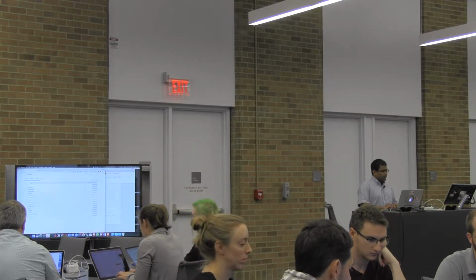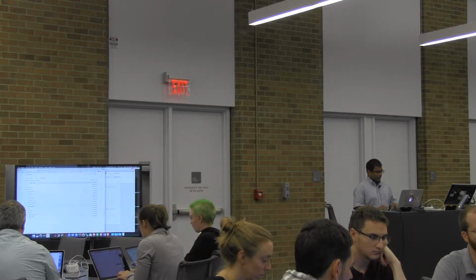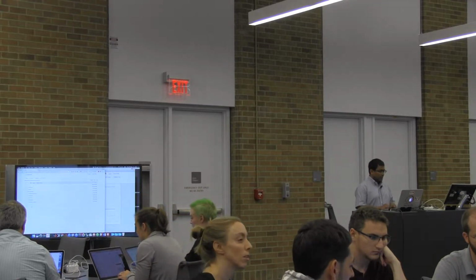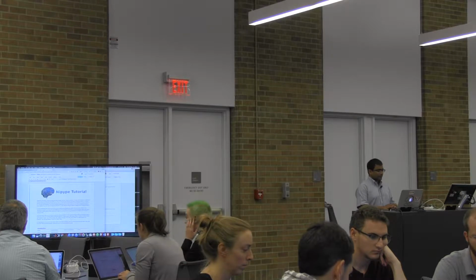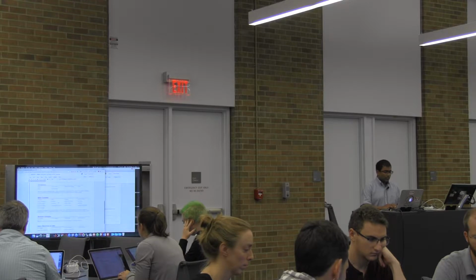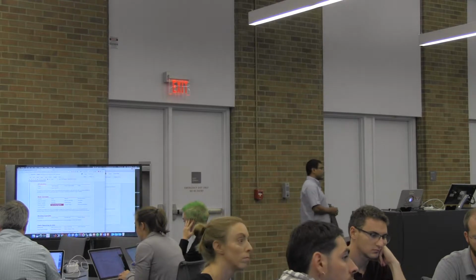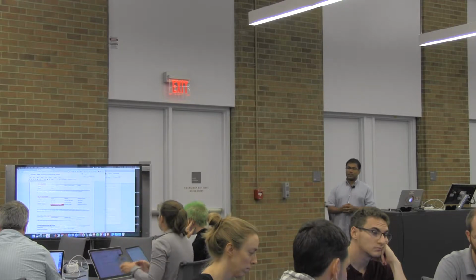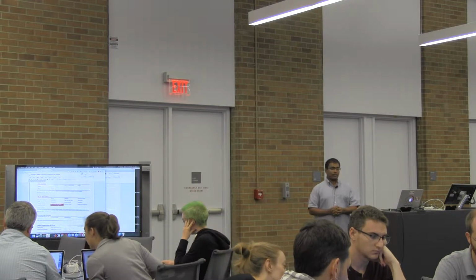If we go back to the Jupyter Hub and click on repos, there is a branch called NiPipe tutorial. And we can click that and click on index.ipynb. So the NiPipe tutorial is actually quite extensive. 90% of this is created by Michael Notter, who is in Switzerland. And it goes through various different concepts and components of NiPipe.